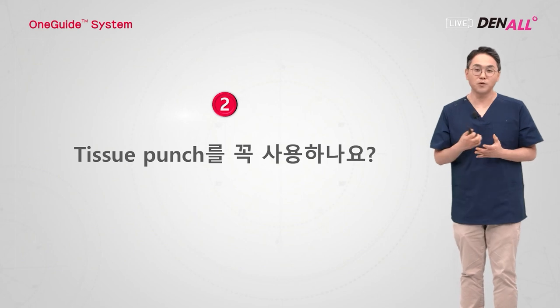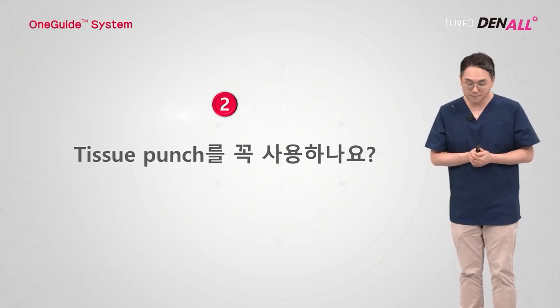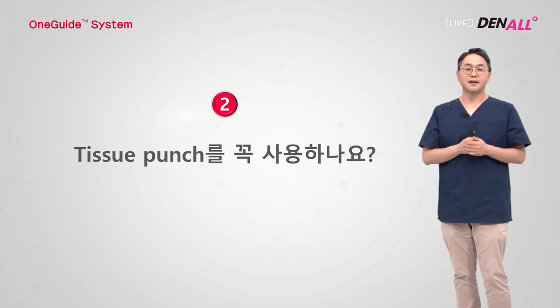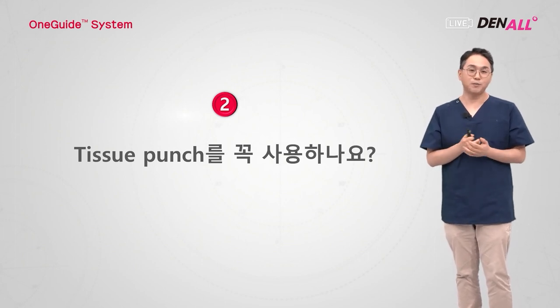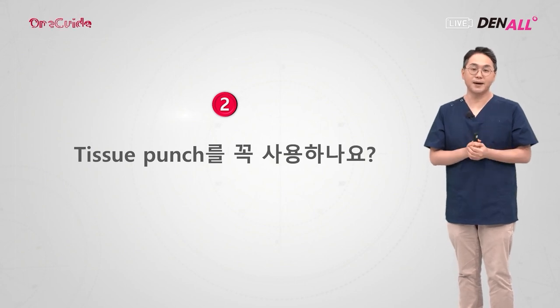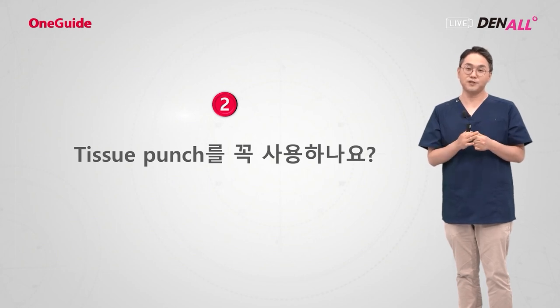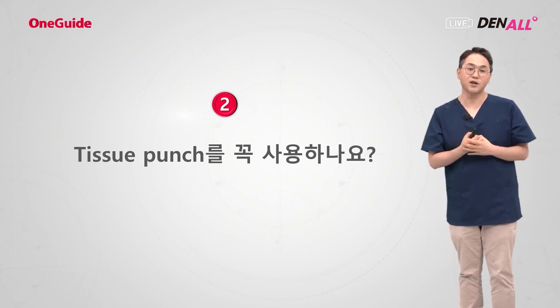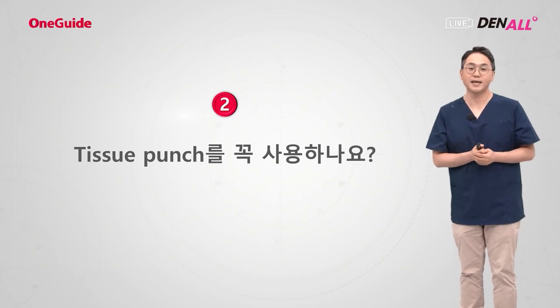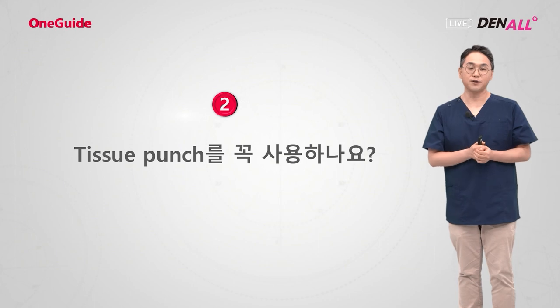The second one is, do we have to use a tissue punch? Can we drill directly? I don't use the tissue punch very frequently. I use it when gingiva is thick, 3 millimeters or thicker. The soft tissue may go into the flutes of a drill, lowering the cutting efficiency and generating a lot of heat. Then the tissue punch can be used, but when gingiva is thin, I drill directly.